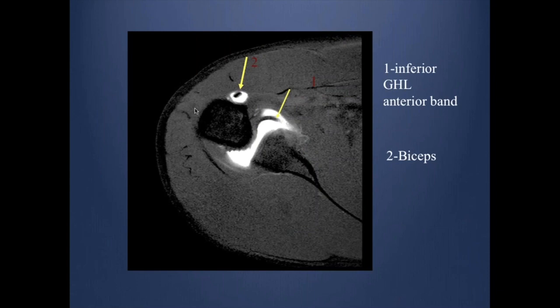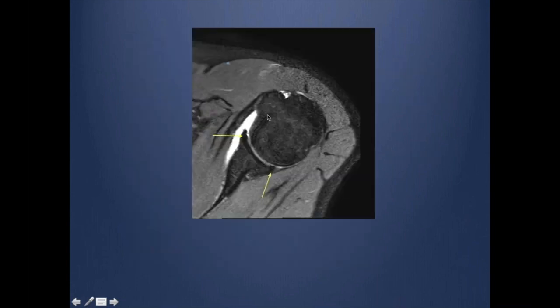On MRI, you get very beautiful anatomy. At the inferior part of the joint, you can see contrast pooling around the biceps tendon within its tendon sheath, and the anterior band of the inferior glenohumeral ligament. Moving more superiorly, you can see the anterior and posterior labrum beautifully — triangular, low signal — with no overlapping with the adjacent subscapularis. That is the beauty of the direct arthrogram.